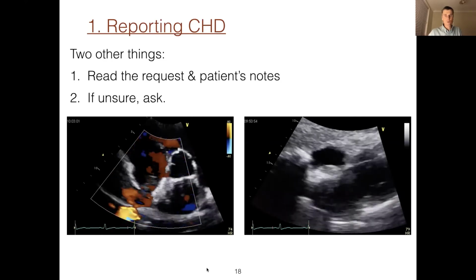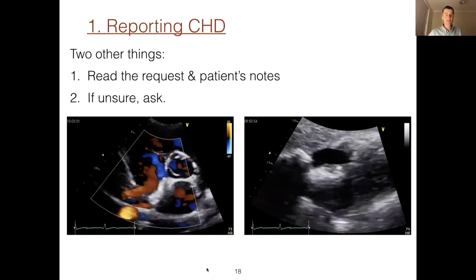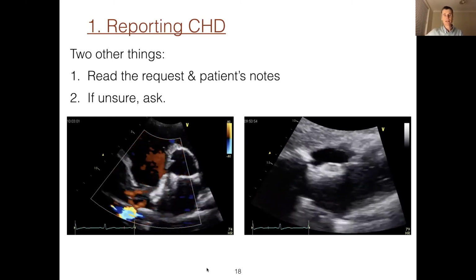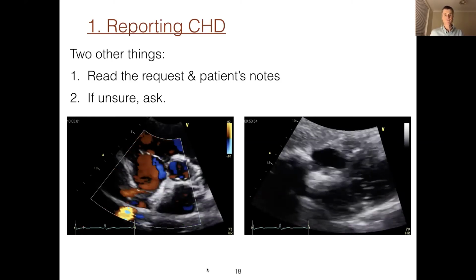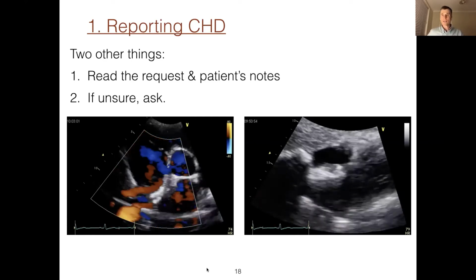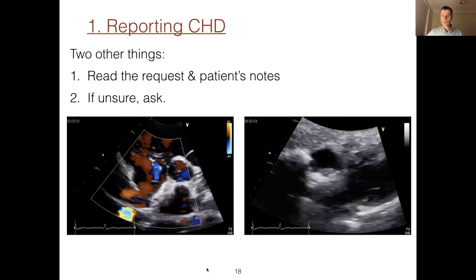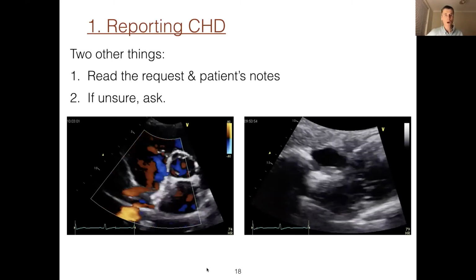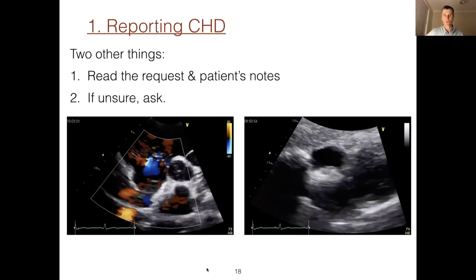Obviously the interatrial septum is much thicker than you would expect to see, and you certainly can't see any indication of a shunt any longer. But if perhaps you weren't quite as familiar or experienced with things, you'd be looking at that thinking to yourself, is that, I don't know, lipomatous hypertrophy, or is it a mass or something like that?